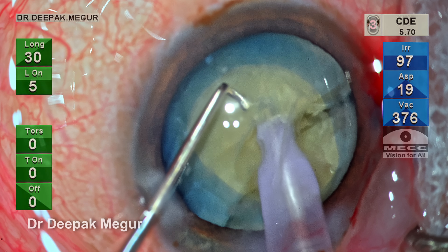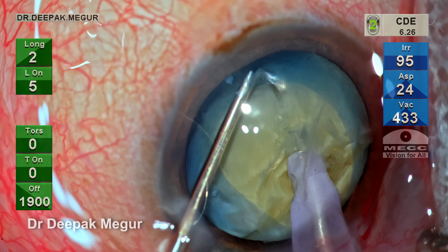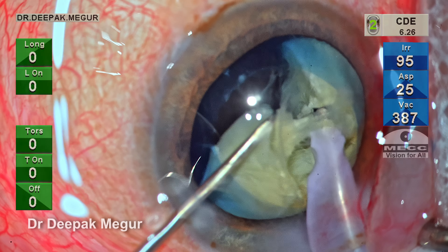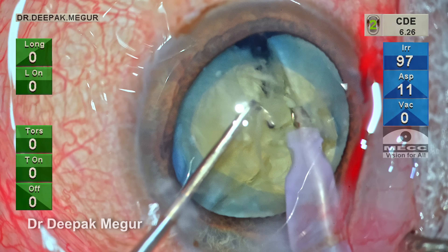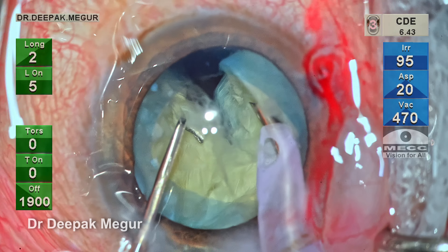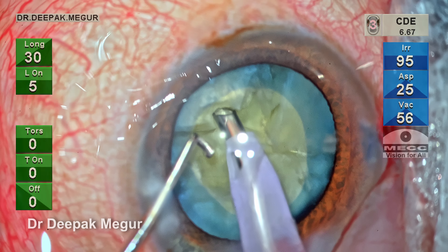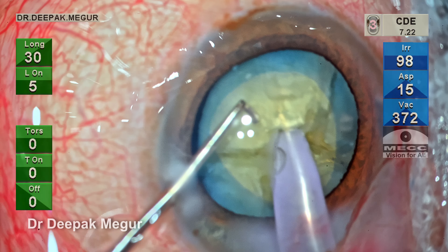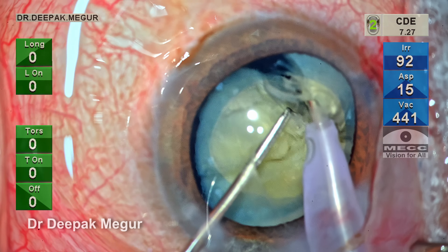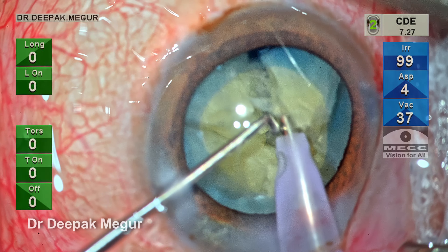Bury the tip into the nucleus, the tip pulls the nucleus towards me to expose the equator, and the chopper goes in directly opposite to the tip, hooking the equator and moving towards the tip. Once the split is done, additional lateral separation maneuvers are performed very gently so that the posterior plate is broken. This maneuver of horizontal chopping is continued very carefully until we have the required number of small fragments. Because the capsular bag will be very fragile in these patients, we need to ensure the chamber is always deep and all maneuvers are as gentle as possible.